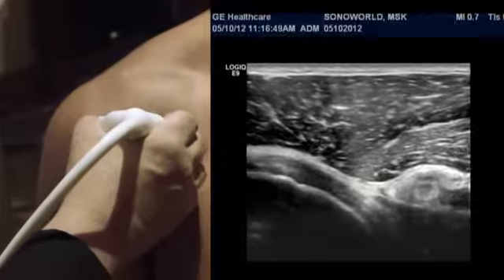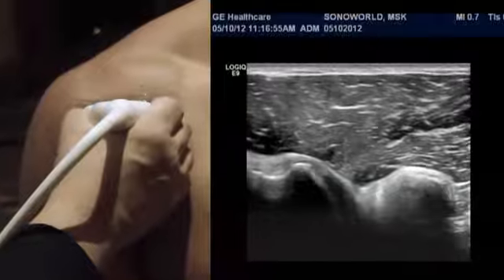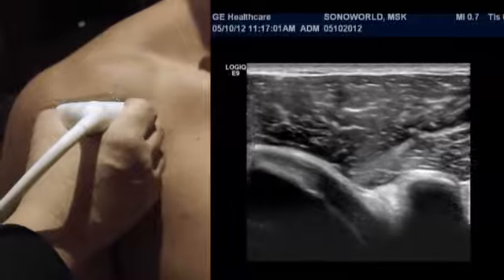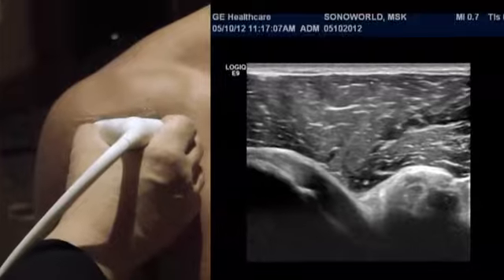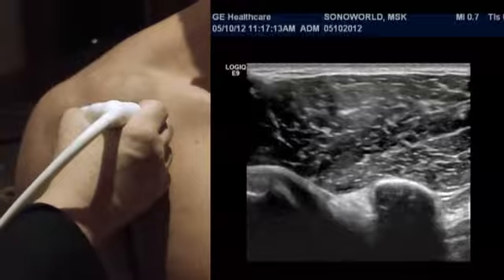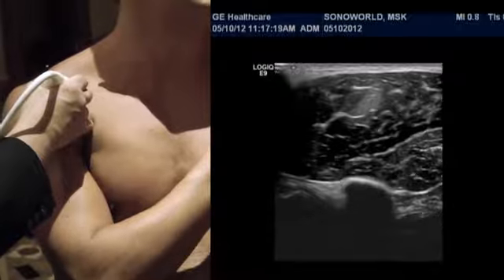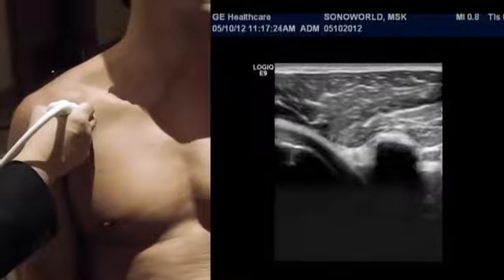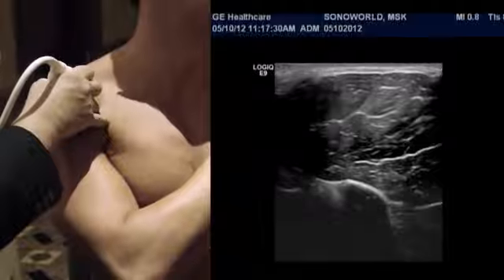Often, if there's thickening of the subacromial subdeltoid bursa or tendinosis of the subscapularis, this could now impinge within this space. The other maneuver, aside from internal and external rotation of the coracohumeral space, is to ask Mike now to put his right hand on top of his left shoulder. This cross chest maneuver also exaggerates the coracohumeral distance. So here now you could see as he does that, therefore we begin to appreciate that it could impinge not only the subscapularis but also the subacromial subdeltoid bursa.